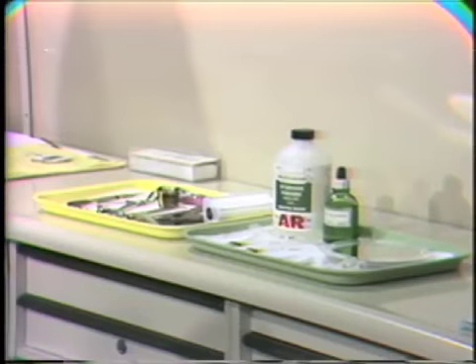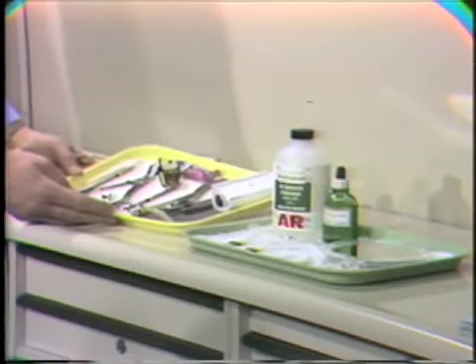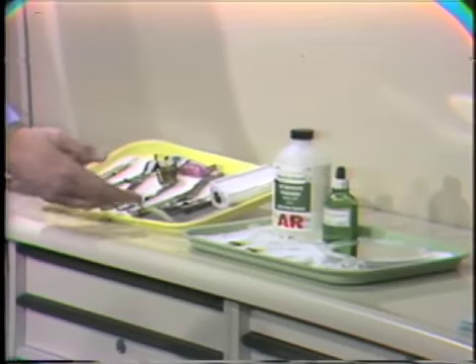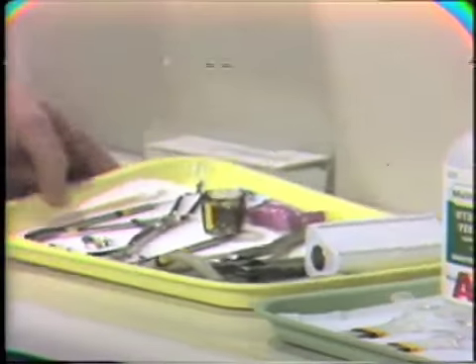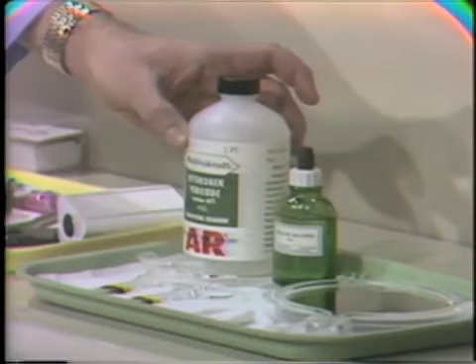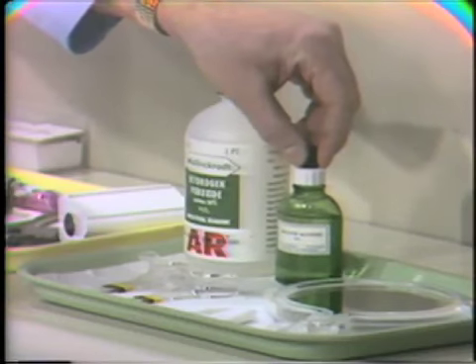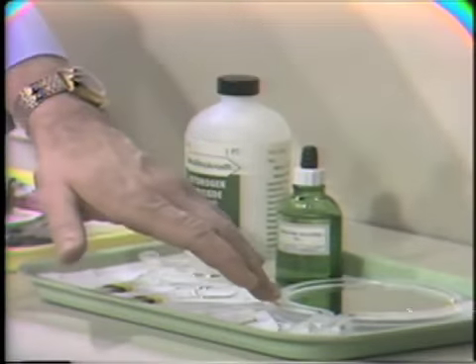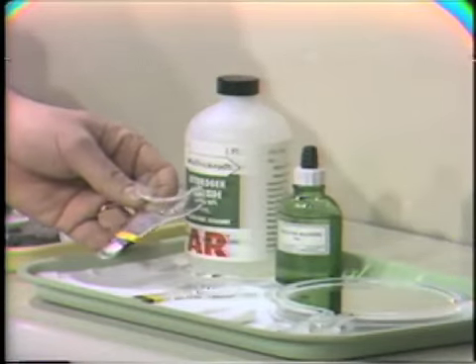I'd like to demonstrate the bleaching technique for you. First, let's look at some of the items that we're going to need to go through the bleaching procedure. First of all, we need the conventional rubber dam setup: dam, frame, clamps, and so forth. We're going to need a spoon excavator and some lubricant. We also need, of course, the superoxol, or 30% hydrogen peroxide, as the bleaching agent. It's nice to have some alcohol to clean some of the lubricant off of the teeth, a mirror so we can show the patient the effects of what we've tried to do, and some mouth retractors for intraoral photography.